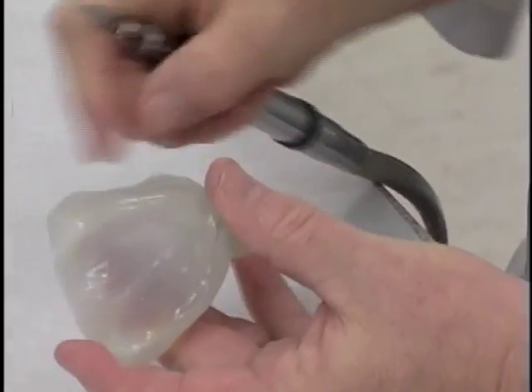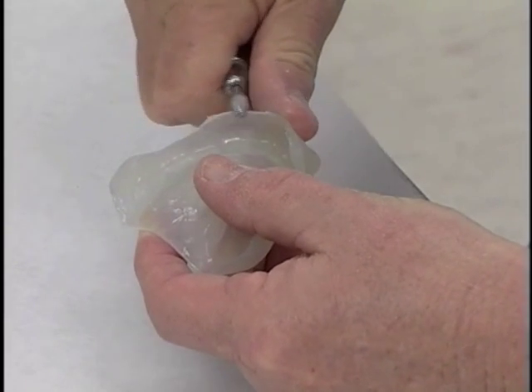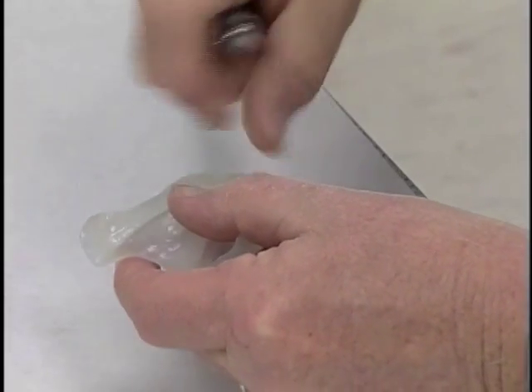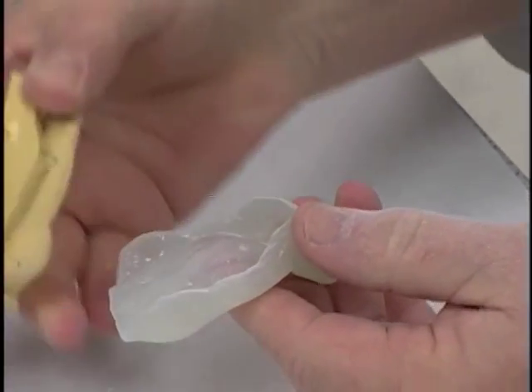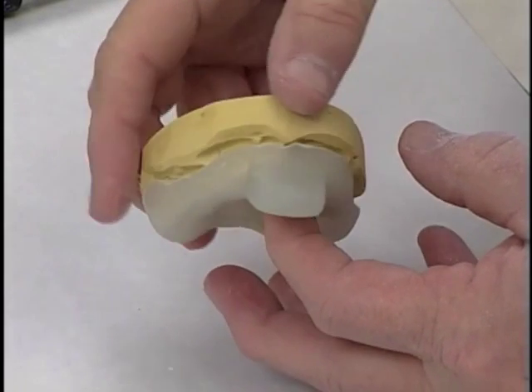And don't be afraid to use your finger to feel these to make sure that all of the sharp edges and jagged edges are off of it, because those jagged edges will injure your patient if you place this in the mouth with those edges like that. After we think we have the jagged edges off, we place it back onto the cast and see if there are areas that need to be trimmed.